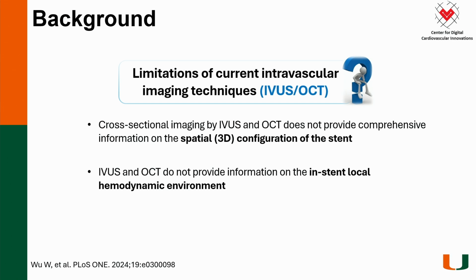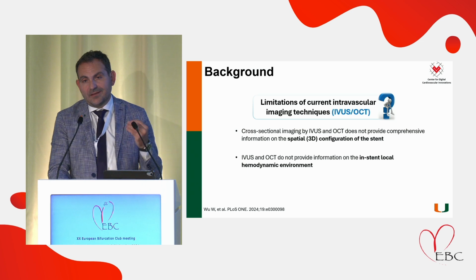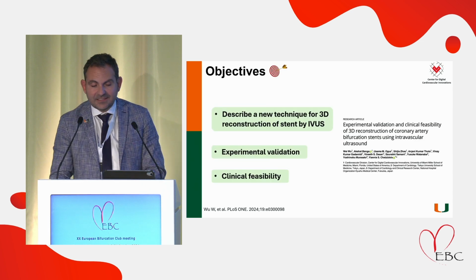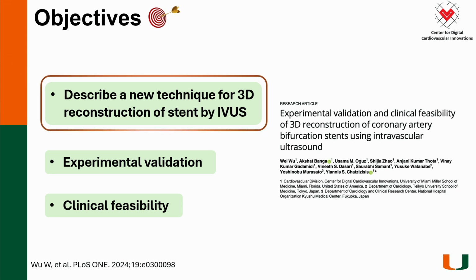OCT has the high resolution that allows us to see the 3D reconstruction in real time when we get the pullbacks. But with IVUS, we don't have this capability yet. So our effort here is to show you how we have this ability. It's possible now with high-definition IVUS to also achieve 3D reconstruction of the stent. So essentially, I'm going to describe this technique, then experimentally validate it and show you some clinical feasibility of how we can precisely reconstruct the stent struts, not by OCT, which we do already, but by high-definition IVUS.